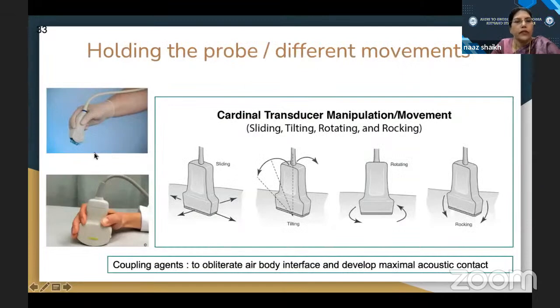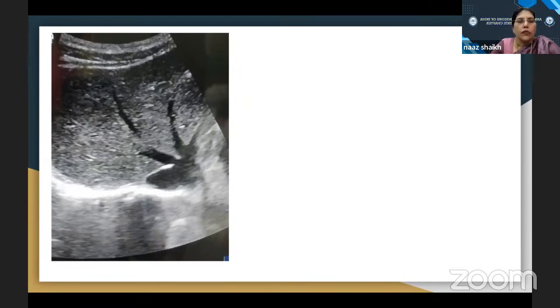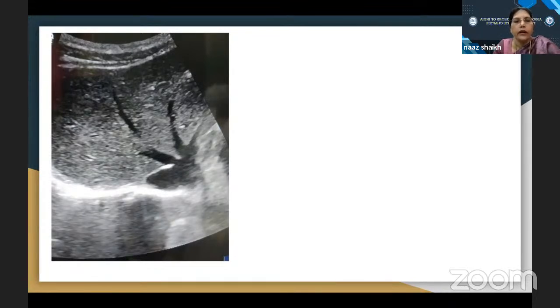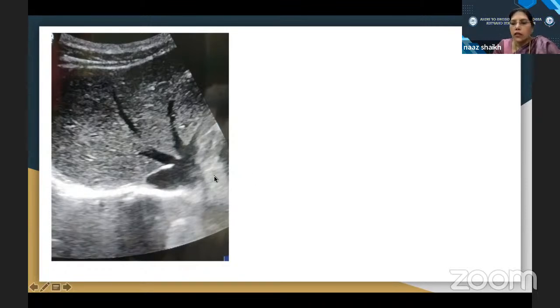Regarding holding the probe: there are different ways to hold it according to your convenience — sliding, rocking, rotating, and tilting movements. You apply coupling agents to obliterate the air-body interface and develop maximal acoustic contact. Now, once you put the probe in the right lower intercostal spaces, through the liver you see the hepatic veins converging into the central vein and IVC — called the bunny sign. Look at the IVC and see how well it is collapsing — it gives information about vascular status: whether the patient is over-hydrated, under-hydrated, or has CCF.